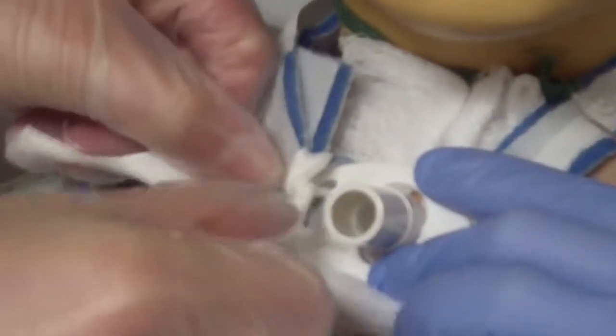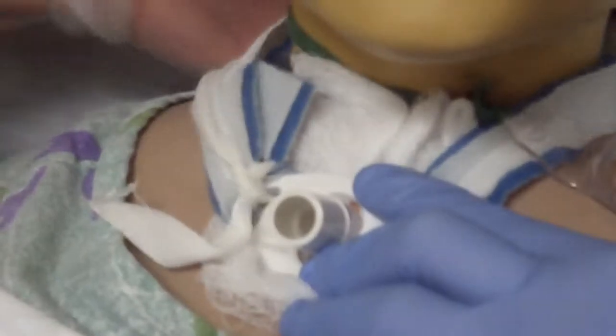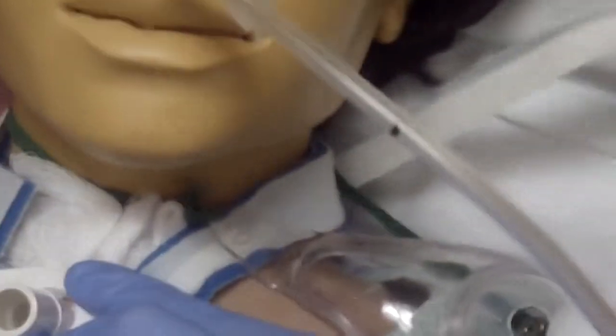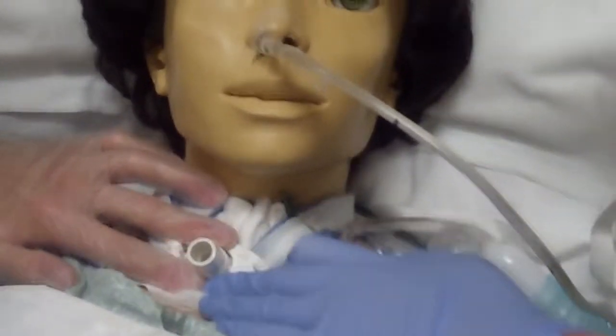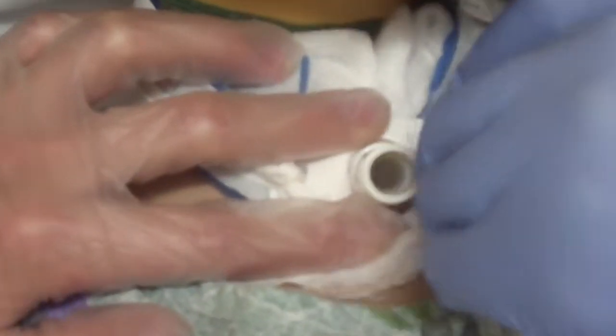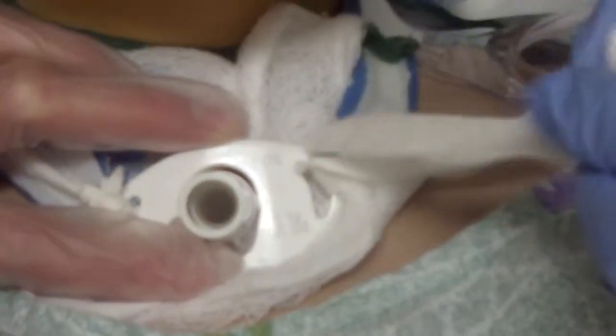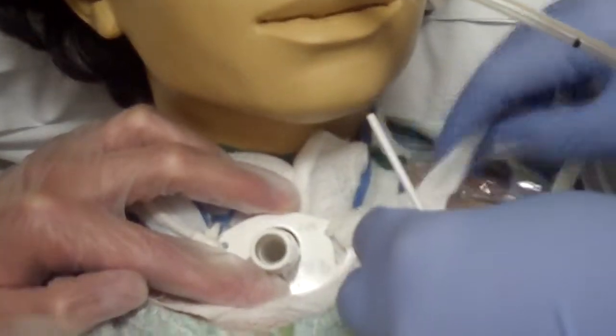once into a knot and then again into a knot. And I'm going to slide it around the back and have Lisa assist me on pulling it through. I'm then going to hold the faceplate while Lisa threads this side through. Thank you, Lisa. And then she's going to tie it into 2 knots again.